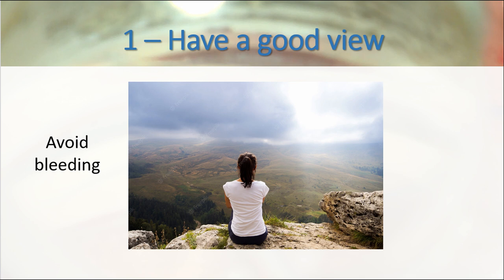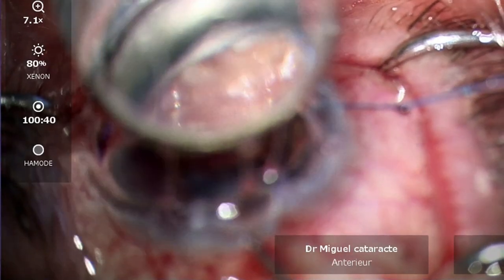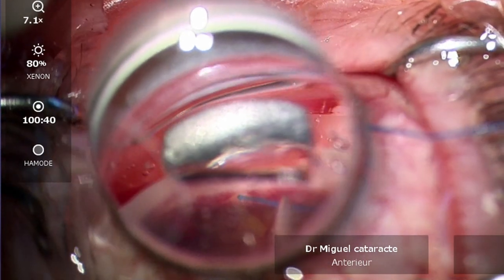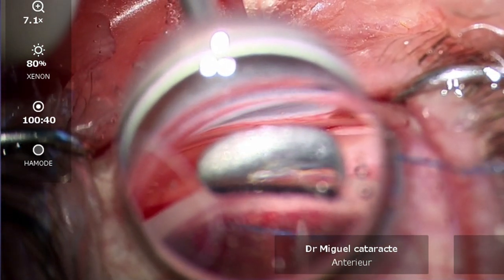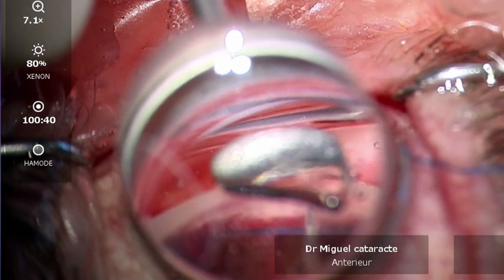The most important pearl for the surgery is to have a good view. The surgery had important bleeding, for which just the right amount of viscoelastic exactly in Schlemm's Canal was used and in the goniotomy — just enough to be able to penetrate through the goniotomy and through Schlemm's Canal. Or you can use a very large amount of viscoelastic to clear the view. There is no problem in using a lot of viscoelastic.